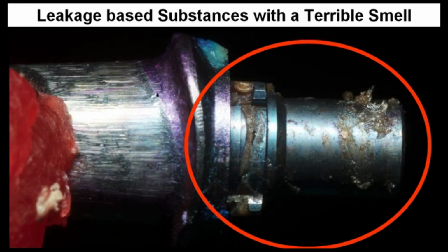But you have an advantage. When you were at home, you took off your rubber boots and dried your feet and everything was okay. But your patients cannot remove the abutment every day to dry and clean it. So the result looks perhaps like this. We have really terrible substances at these abutments with a terrible smell.